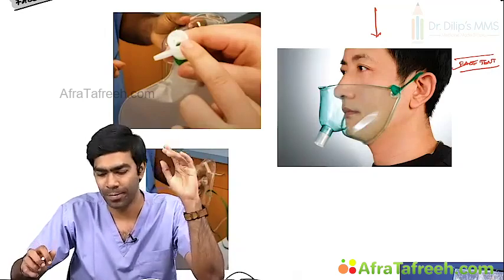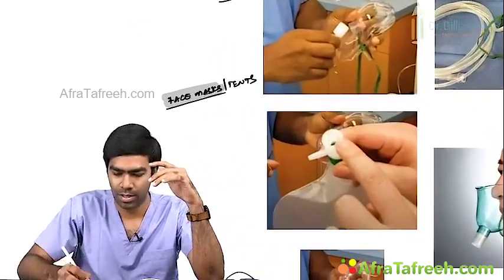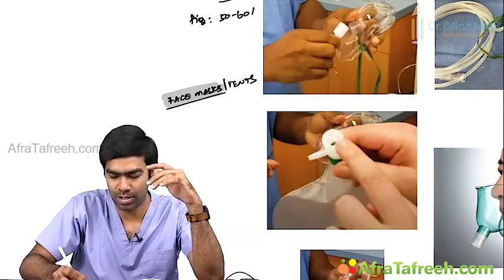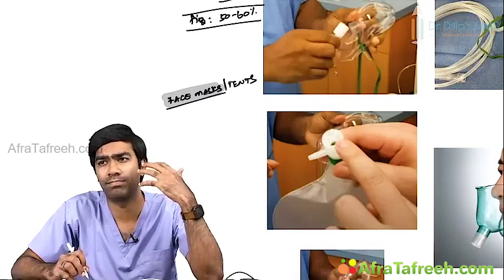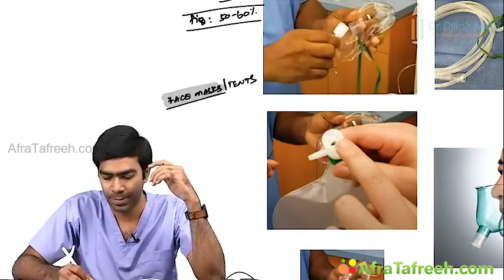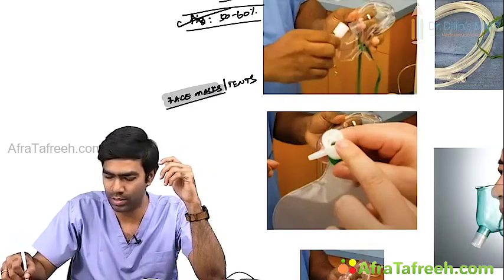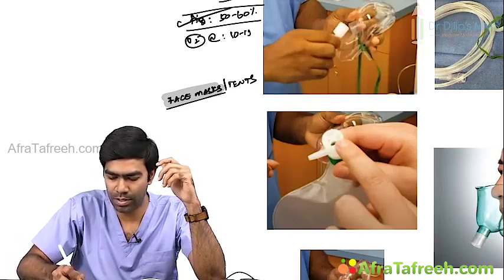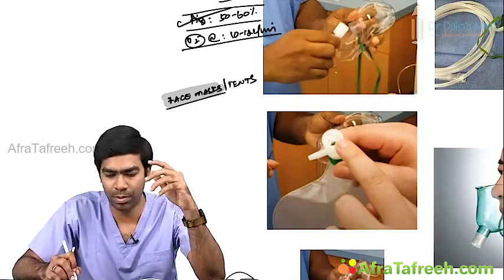Very easy to create. But this does produce a little bit higher FiO2 compared to the simple face mask. FiO2 delivered by this will be 50 to 60%, whereas a simple face mask will deliver only 35 to 50%. We saw that. And oxygen flow rates can be set a bit higher, at 10 to 12 liters per minute, because you have the reservoir bag, so they can hold a little bit more oxygen.